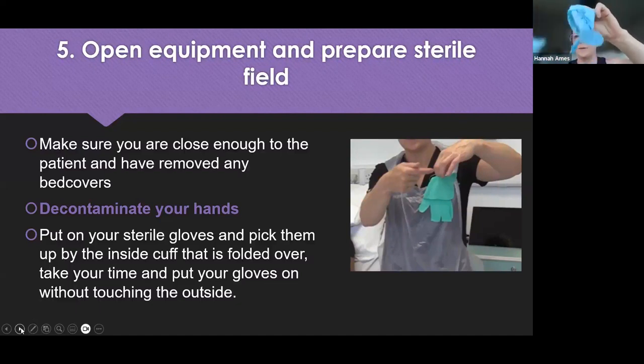Again, I'm going to pick it up by the cuff. And what I need to make sure is my gloved hand does not touch the skin on my other hand at any point during this, okay? Otherwise, you're going to have contaminated your sterile field and it'll be a critical fail. So again, take your time, because when you rush this stage, it's when you make mistakes and you break your sterile field, okay? So I can touch the outside of this glove with my sterile glove now.